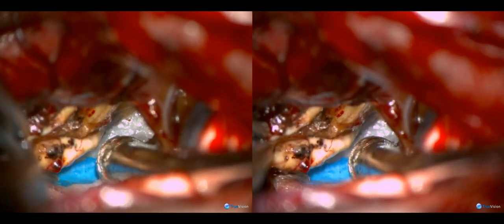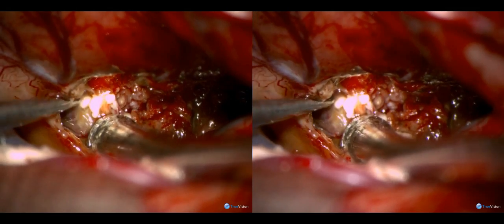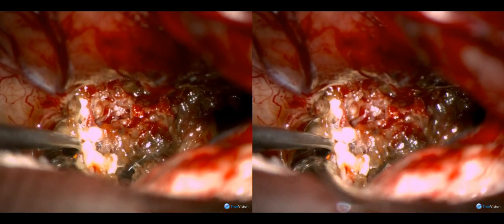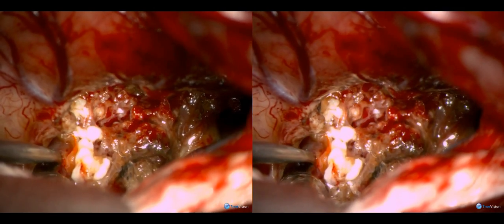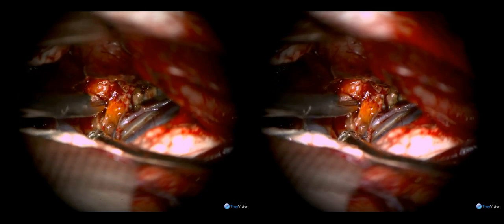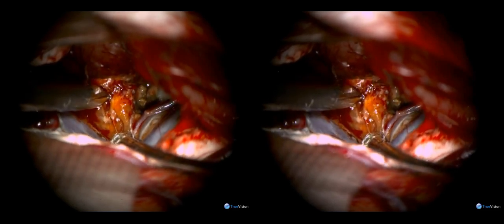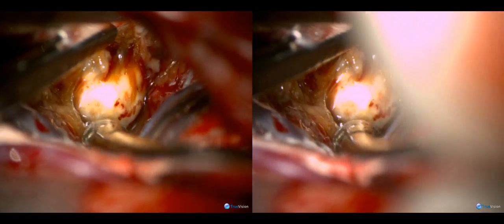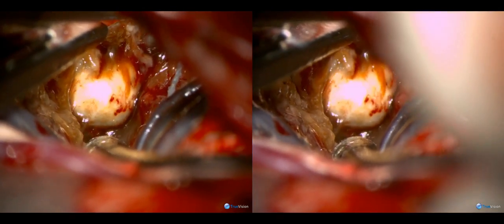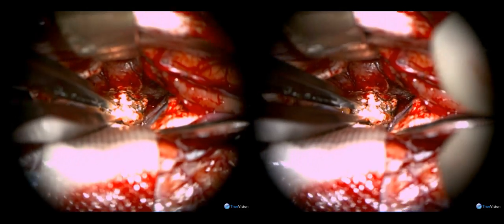The posterior border of the malformation is being dissected here. You can see the extent of this large malformation and its various portions extending both medially, posteriorly, and laterally. Here the plane of separation is being developed. You can see this nice gliotic margin that helps facilitate the separation. Another piece of malformation is removed and we continue our dissection laterally.